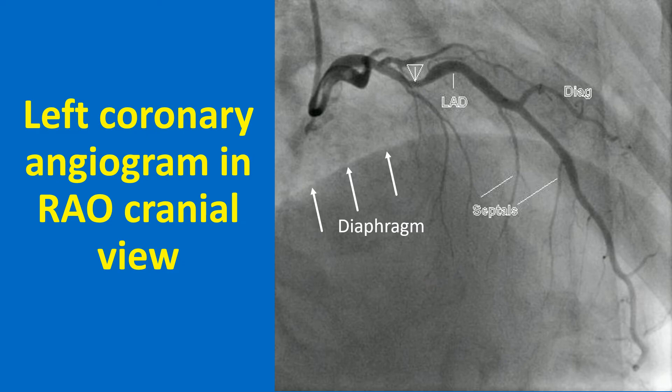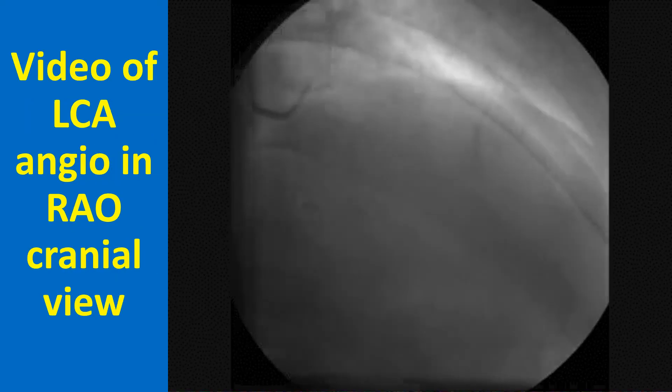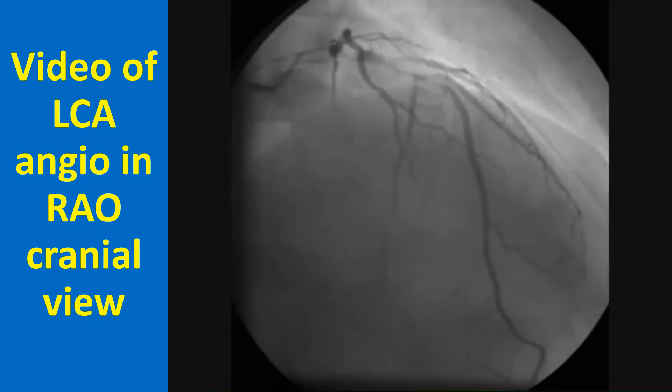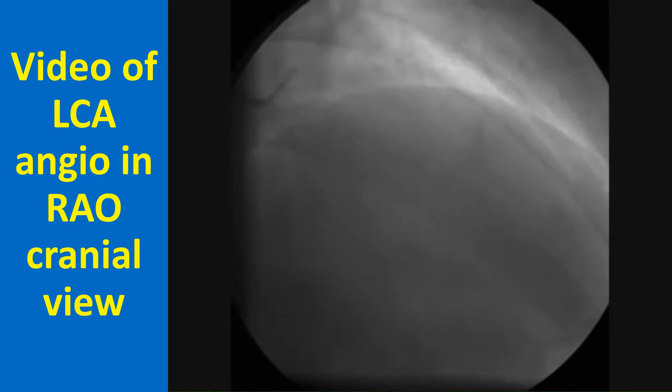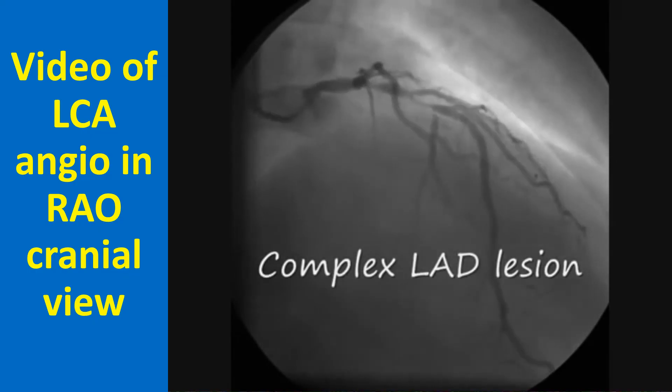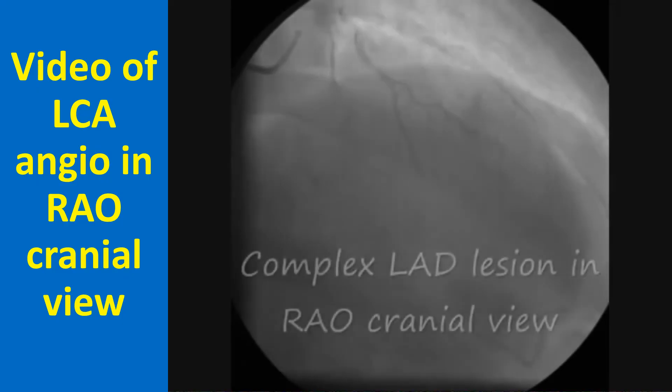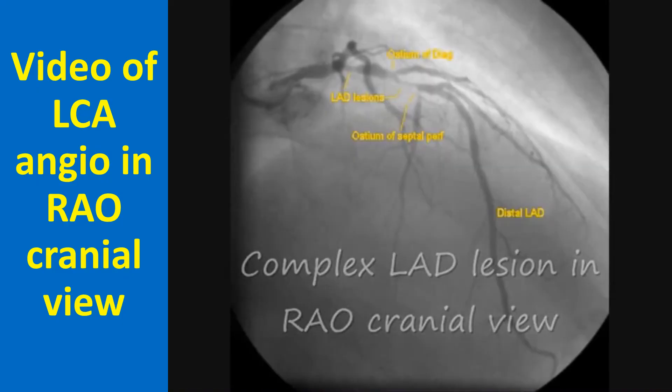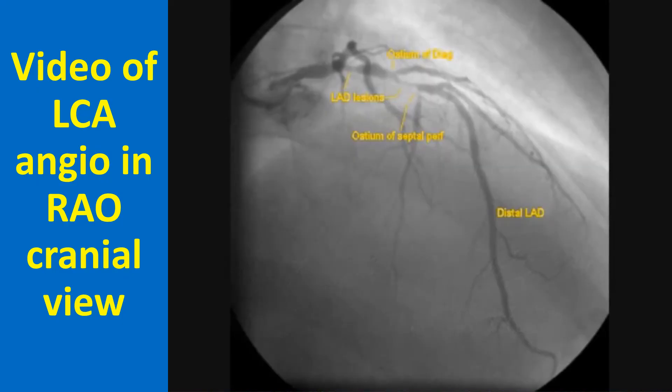Rightward angulation in RAO cranial view is useful in reducing overlap of the proximal LAD by the vertebral spine and the catheter. It may be noted that in both cranial views the diaphragmatic shadow goes high up into the field. A video of the left coronary angiogram in RAO cranial view shows a complex lesion in the LAD, with the LAD seen wrapping around the apex — a Type 3 LAD.